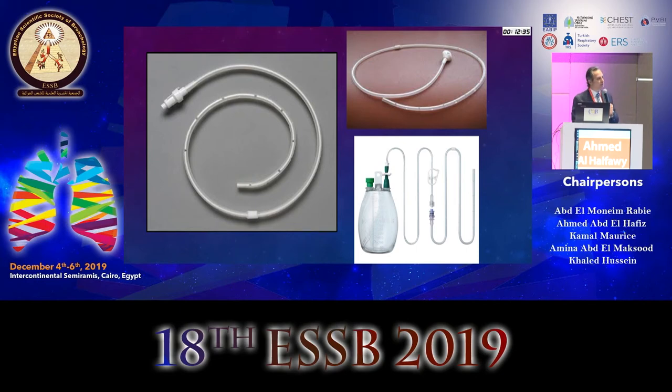I'm sure you've seen it in other presentations. But this is how it's designed to be drained, using a plastic vacuum bottle that contains a vacuum. Essentially, when you connect it to the tube from this side, the vacuum will aspirate the fluid.